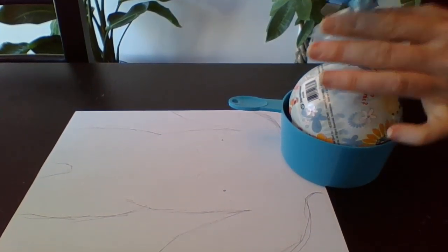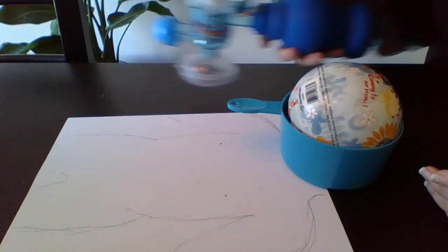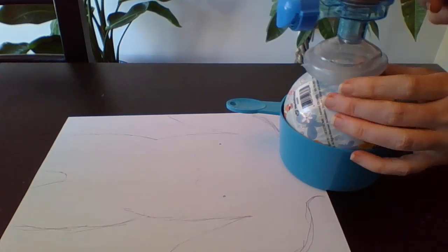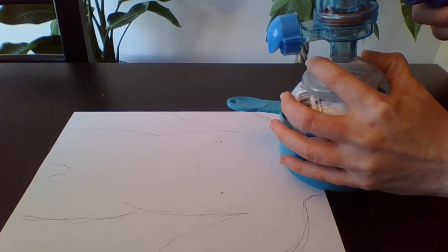And this is a 2-person job, but I'll show you what each person would be doing in that case. There's also a couple different ways. I think the best way to do it in this case for the compression is, again, you have your mask this way, but now you're going to have the bag up above the baby's head because you're going to have someone else on the other end of the baby doing the compressions while this person is doing the ventilation, alternating with the compressions.